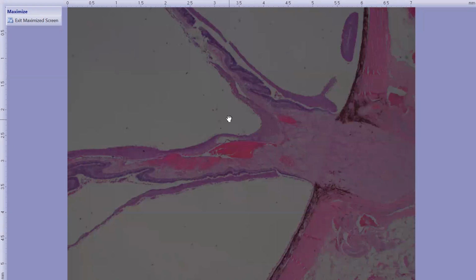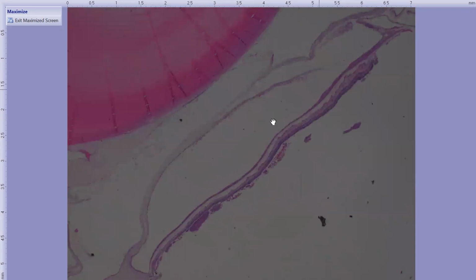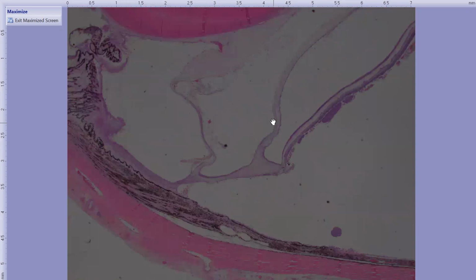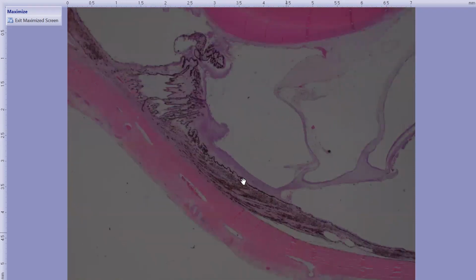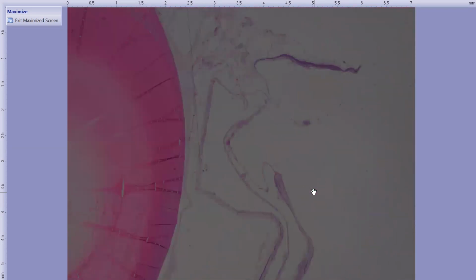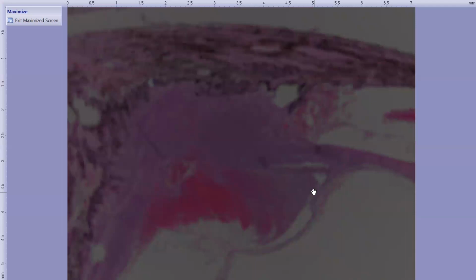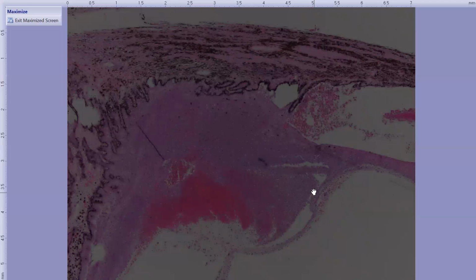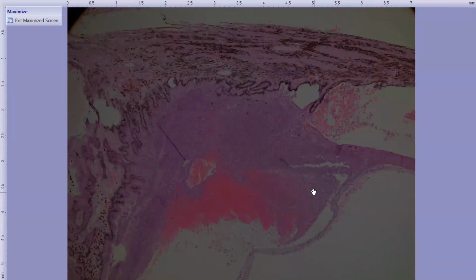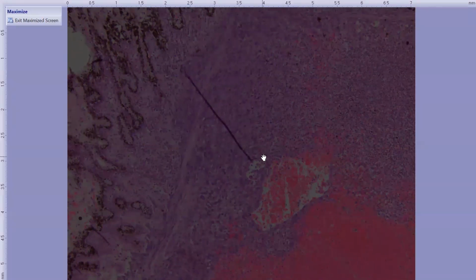So we have a population of cells that is carpeting surfaces in the eye. So it is very densely cellular, evidenced by how purple it is. So there are two options for this, either inflammatory or reactive, or neoplastic. This pattern of cells carpeting surfaces in the eye immediately makes us think about metastatic disease, metastatic neoplasia specifically. So let's go ahead and... And in fact, this one is interesting because it's both inflammatory and neoplastic.